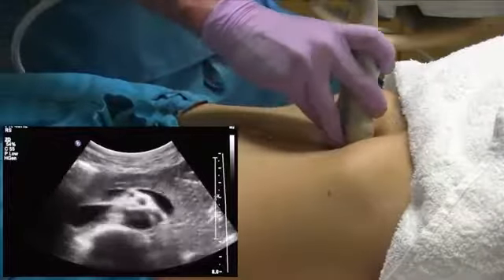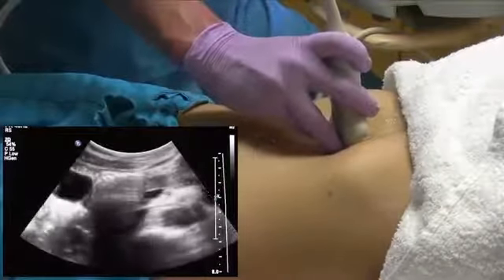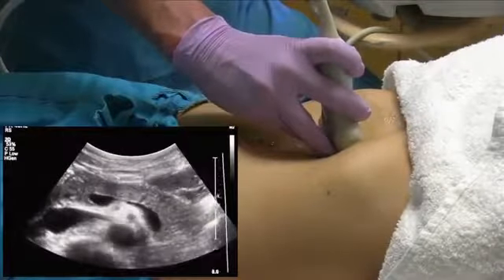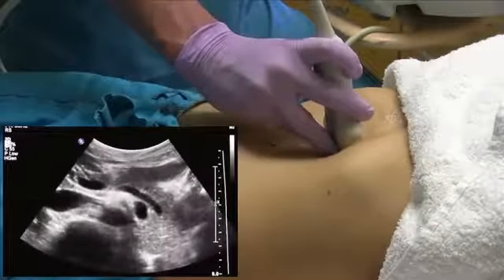We'll also try to look at the head and uncinate process all the way down to the tail of the pancreas. In most patients, you probably won't be able to see the entire tail just because it dives deep from this position.